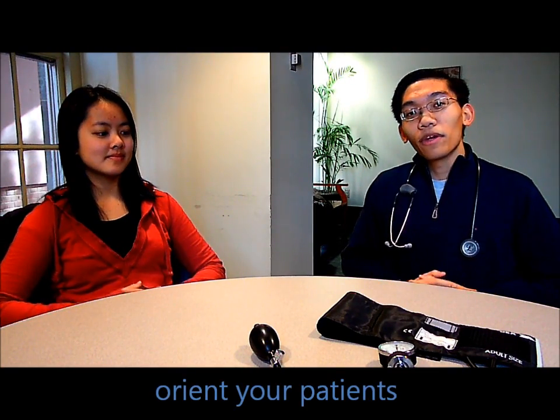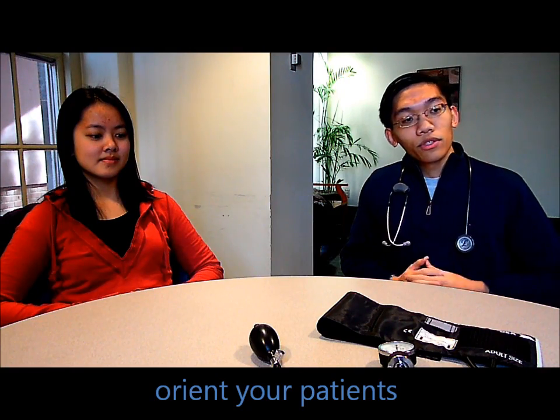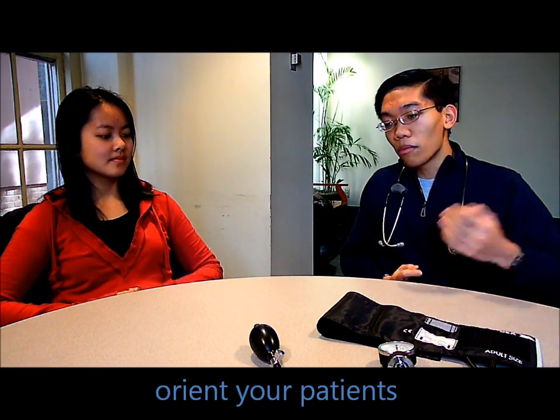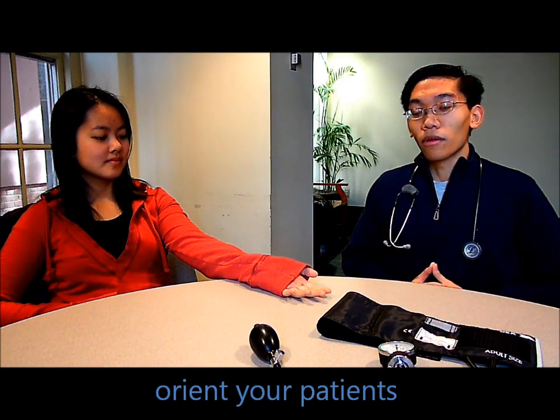First, you want to orient your patient and prepare them for the blood pressure screening. Instruct your patient to outstretch their arm with their palm up on a flat surface like a table, and have them expose their upper arm. If it's not possible for the upper arm to be exposed without constricting the upper arm, then ask the patient to remove their outer layer of clothing so that the cuff can rest directly on the skin of the upper arm.